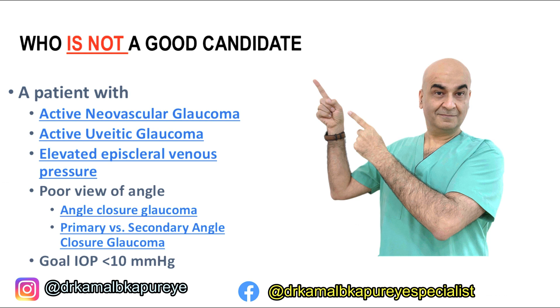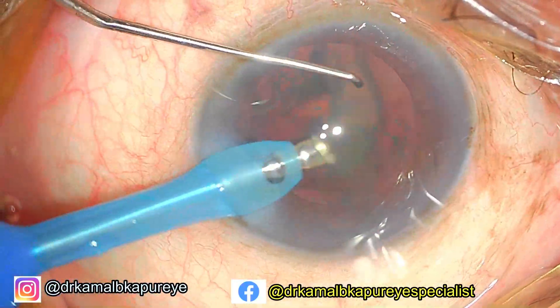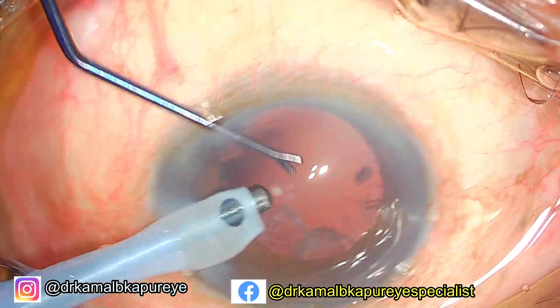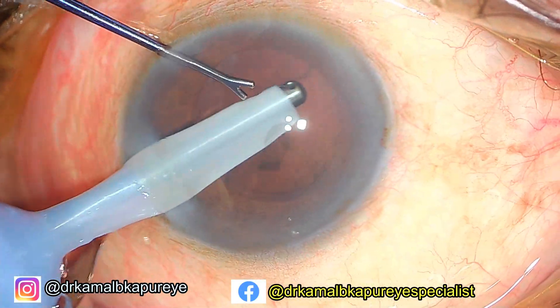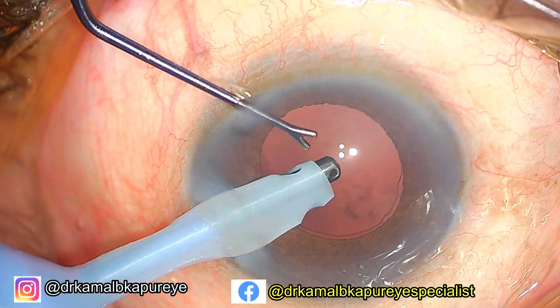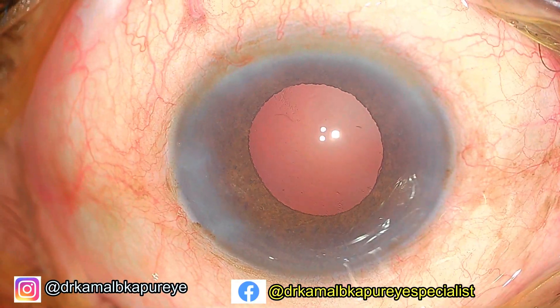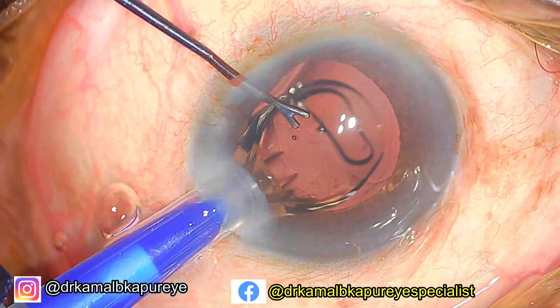We proceed by removing the cataract first. After cataract removal, ensure that incisions are slightly less limbal and that there is no ooze of blood, as blood can encroach under the gonioprism lens and obscure vision. Always use a cohesive viscoelastic, and it is a good idea to add a miotic — in this case we are using pilocarpine.